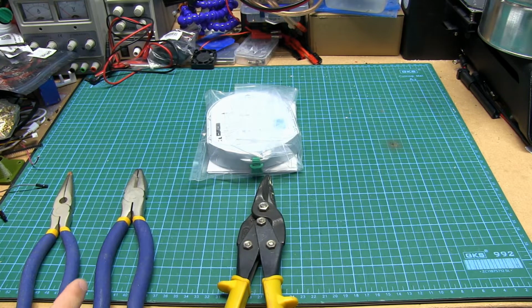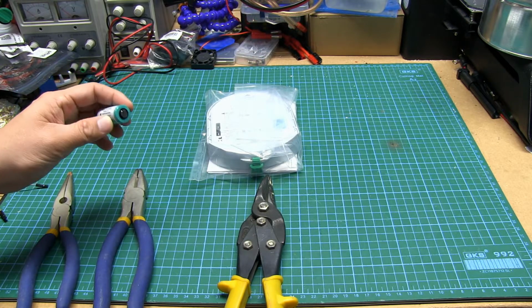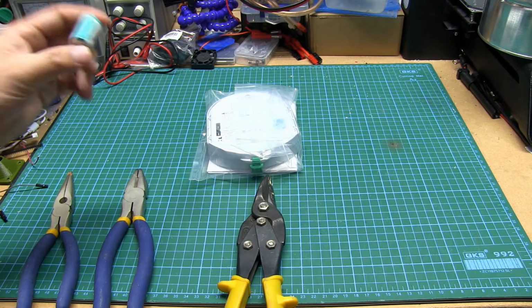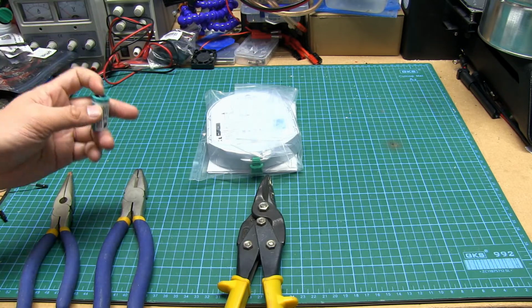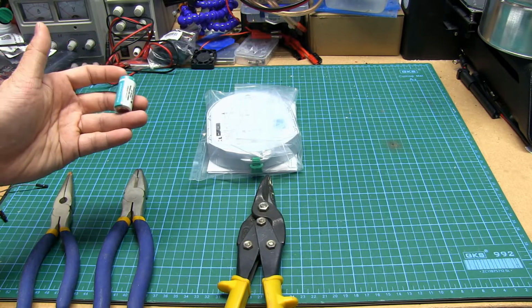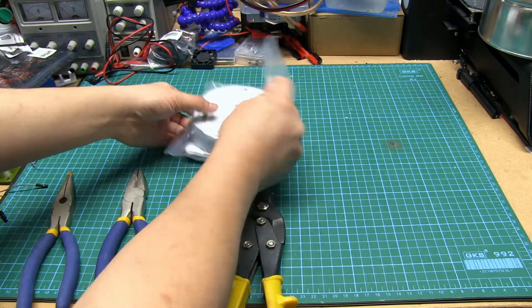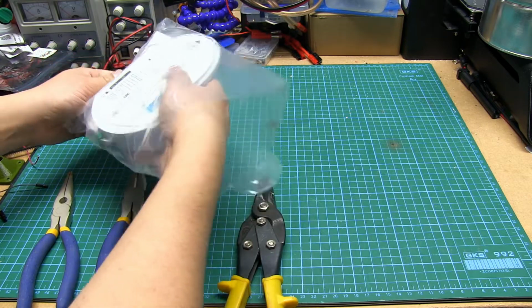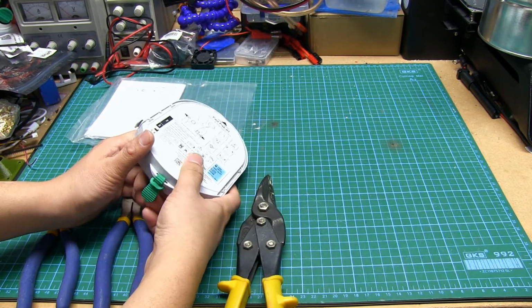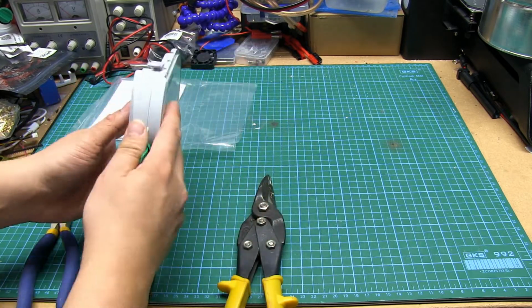Now, I suspect that, like many other defibrillator battery packs, these use CR123 lithium primary cells. These are non-rechargeable, relatively speaking, high current batteries that store for a very long time and otherwise provide good power. The pack itself, I'm going to tear into it now, is expired. This is the only expirable component of that defibrillator. The defibrillator itself doesn't expire.